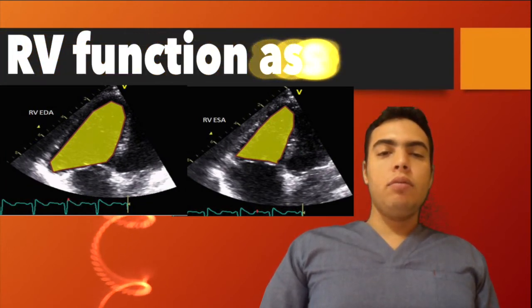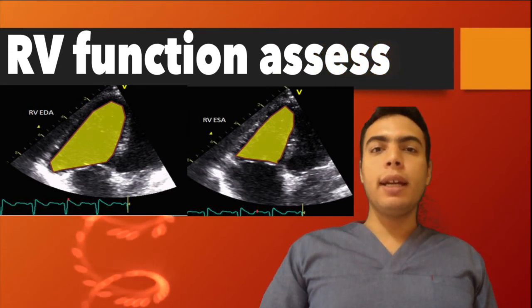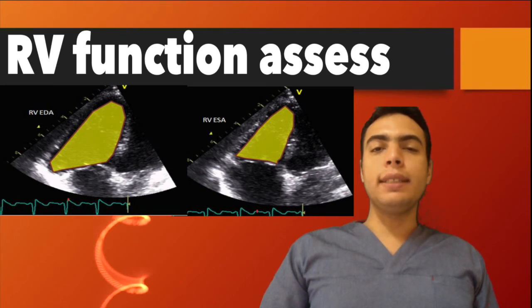And now with the right ventricular assessment. In the right ventricular assessment, actually there are a lot of techniques to assess the systolic function.